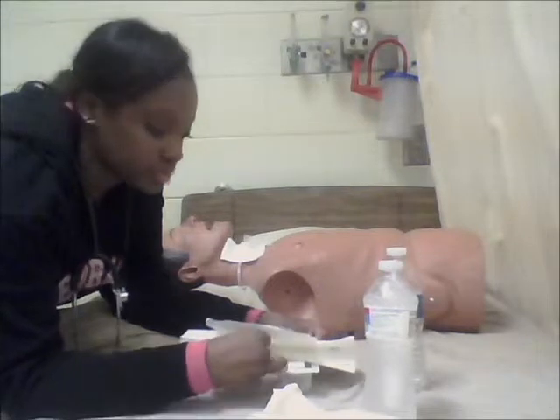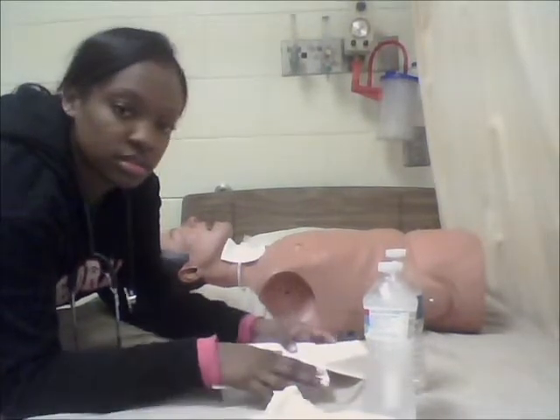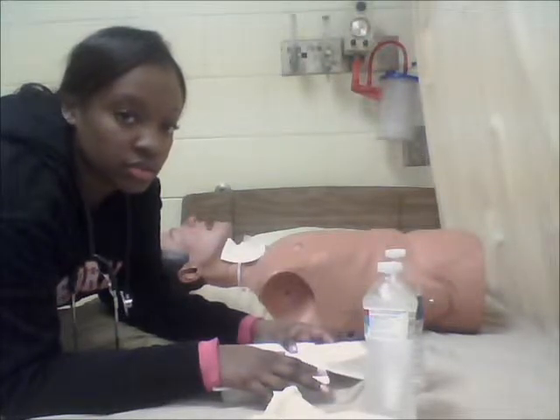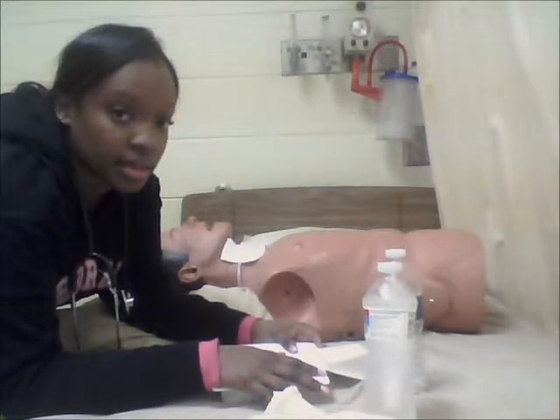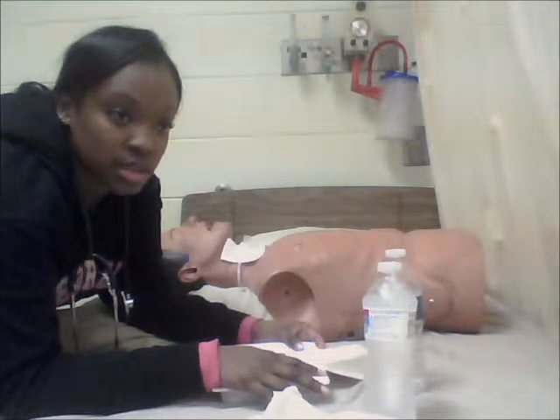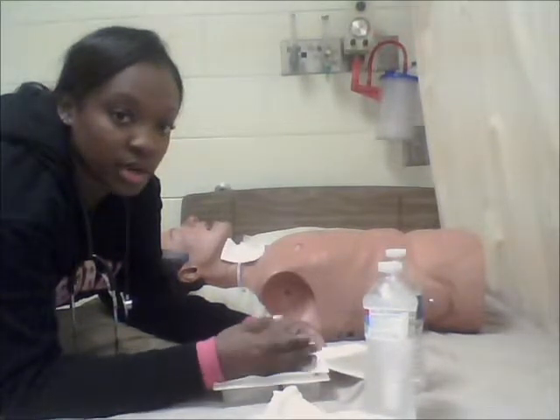Hello, I'm about to perform tracheostomy care. First, I'm going to review the chart and see when the trach was placed and how long ago the trach was cleaned. And then I'm going to go into the patient's room and let them know about the procedure and what I'm about to do.